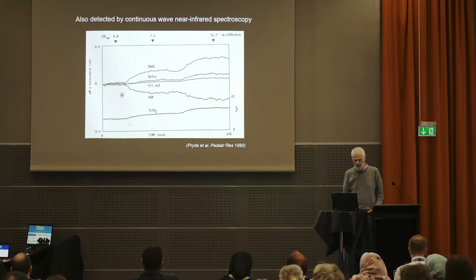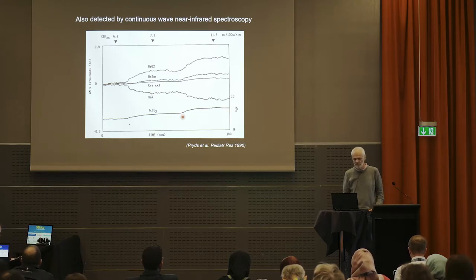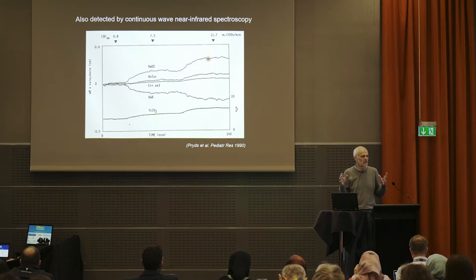And this is very stable, and then the ventilator is set here, allowing PCO2 to rise. And up here, he also measured cerebral blood flow with xenon, and you see that low number, and then when the ventilator is set, transcutaneous CO2 increases, blood flow increases as measured by xenon, and the amount of blood in the brain, total hemoglobin, increases a bit because of the vasodilation, so there's more blood in the brain. And there is particularly much more oxygenated and less deoxygenated hemoglobin, so the brain gets sort of pinker. And then he reset the ventilator once more to decrease ventilation. PCO2 increased even more, blood flow increased, and the brain became even more pink. So this is just illustrating that this is a very strong mechanism.